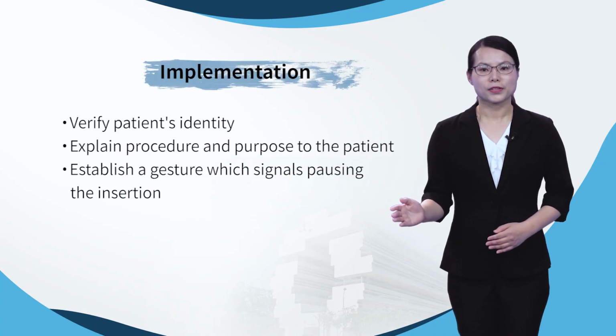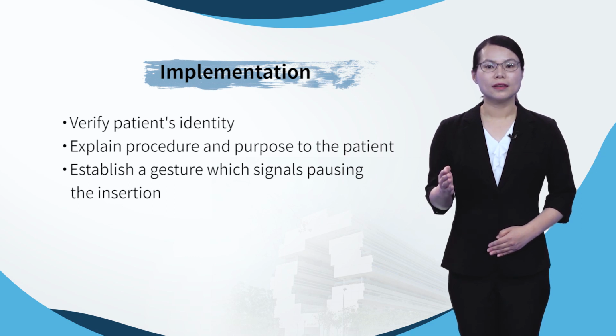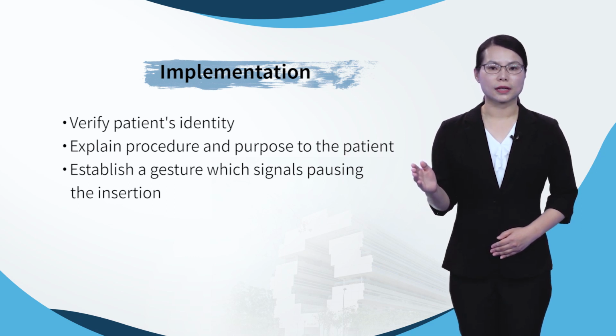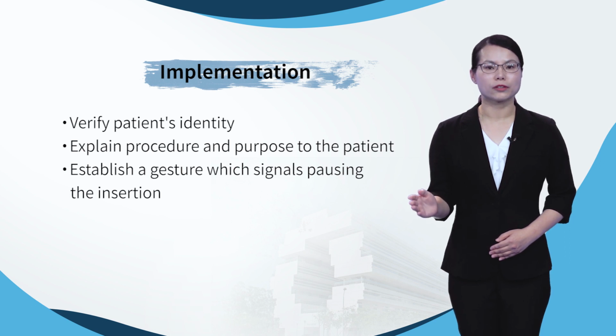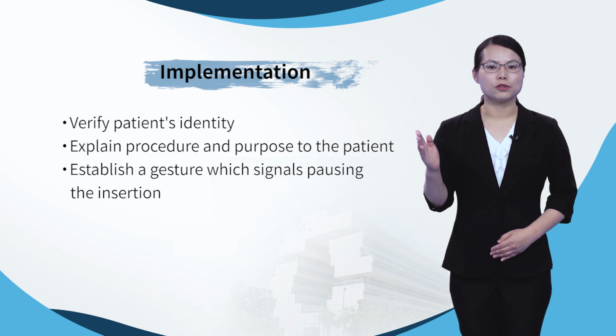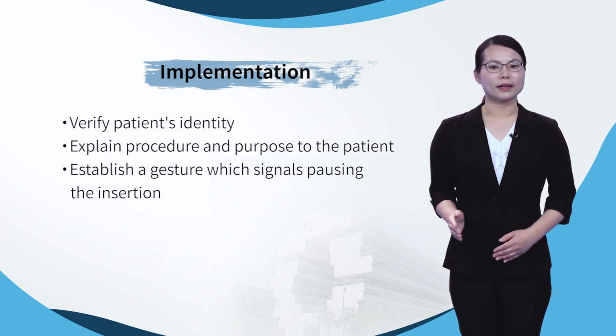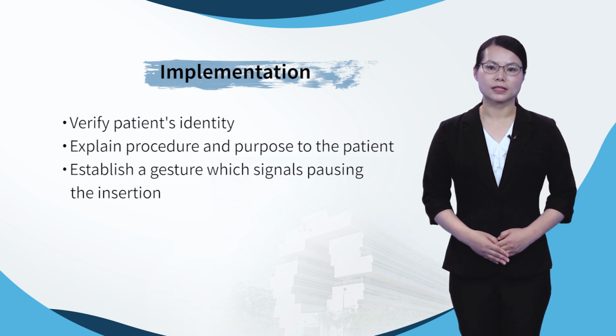We will check the patient's identity. We should tell the patient that he or she will experience discomfort or gag during tube insertion. We can suggest the patient to raise a hand or finger to indicate distress and a desire for us to pause insertion for a moment.